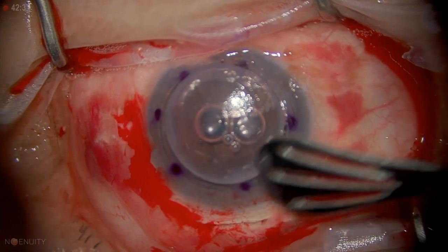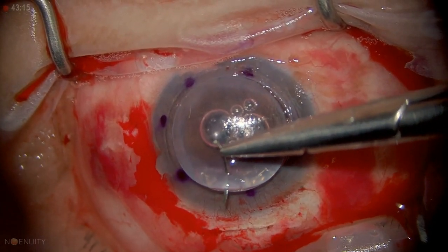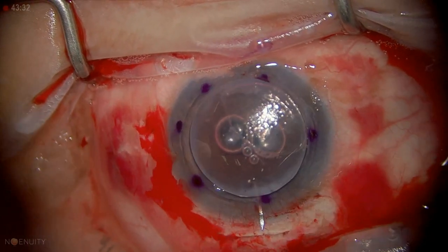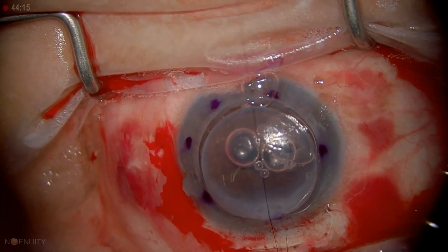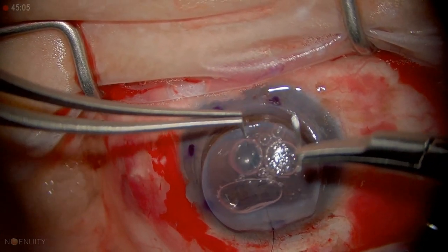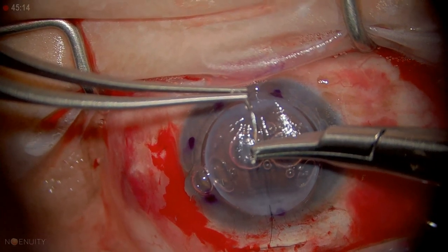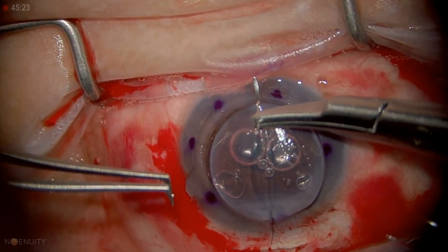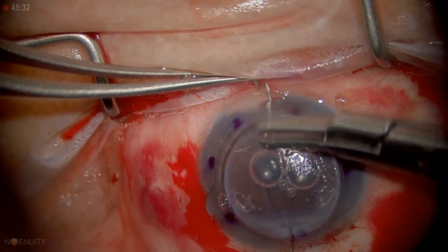There's a little bit of arcus here — I don't love that. So I want to put the arcus up here on top so it's covered by the patient's lid. The depth is 50% here in the donor, and then into the recipient I'm going to go full thickness or close to it — just right here and then out at the limbus. Watch how tight I tie this. I lock it forward like that — it's so tight you can see the tissue getting white. I grab it and look to see where the bend goes and make sure the same distance is on each side. Then I go half thickness. This is the most important suture.